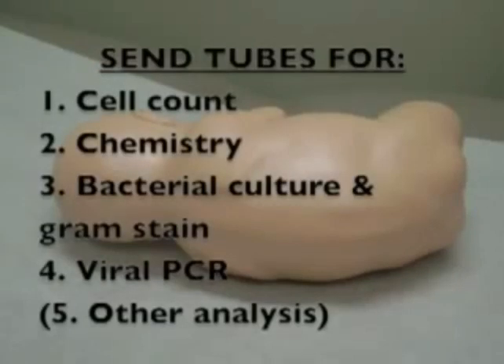You will typically send off your tubes for cell count, chemistry, bacterial culture, and gram stain, and viral PCR. Other fluid analysis may be necessary depending upon the indication.